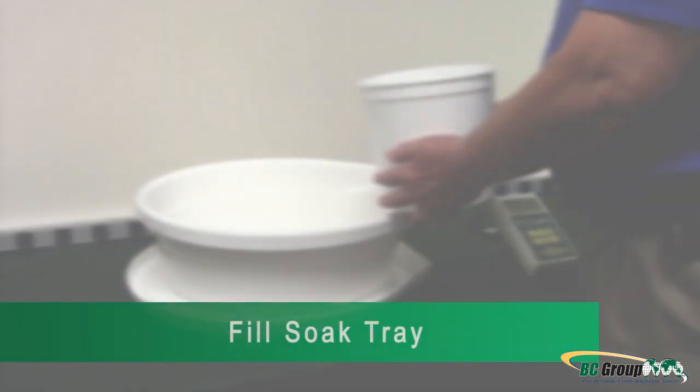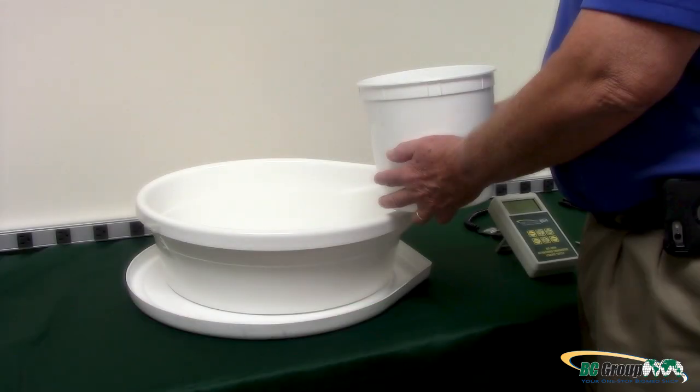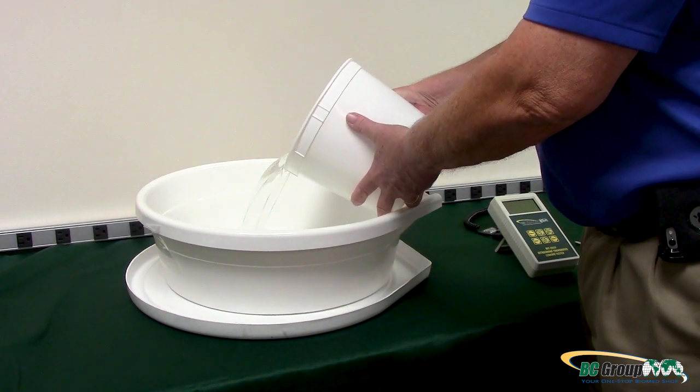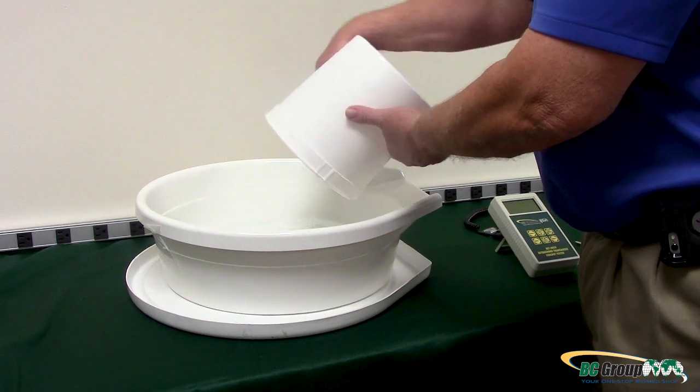Step 1: Fill the soak tray. When filling your soak tray, use the same cleaning agent for cleaning the ultrasound probe. You can also use tap water.